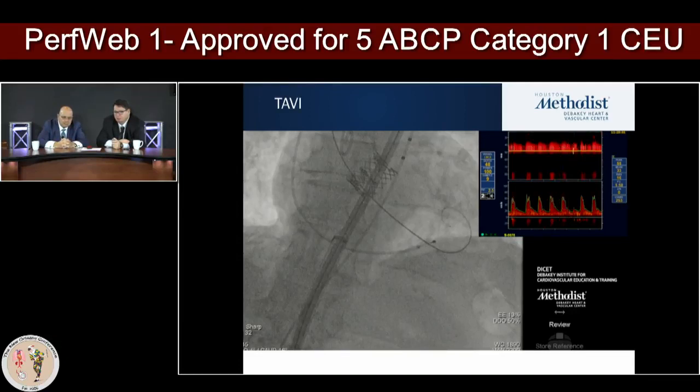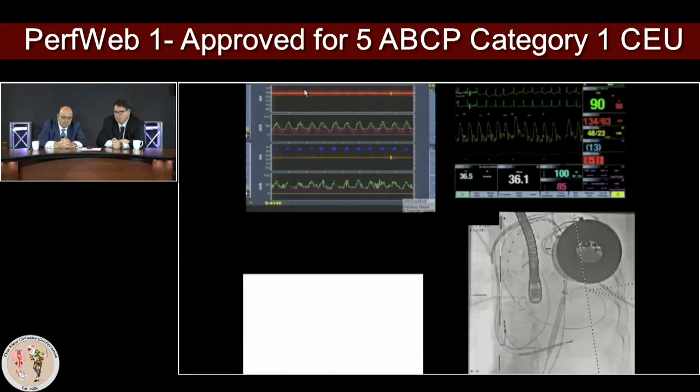let's see the next one, please. And this is, again, a synchronized video. Can you play it for us, please?